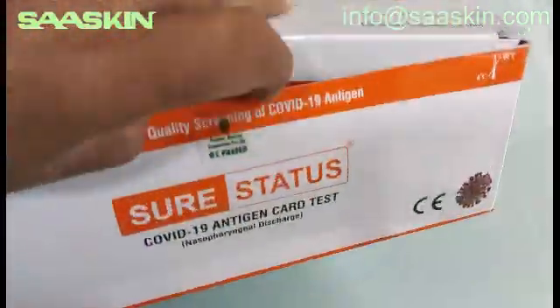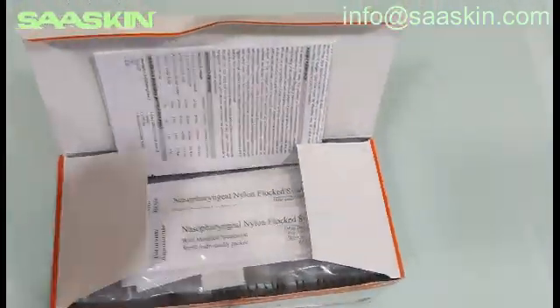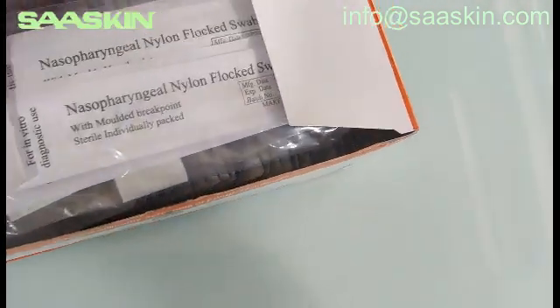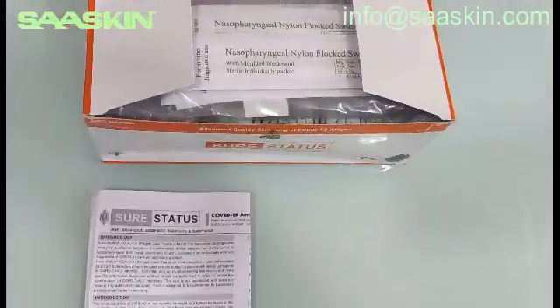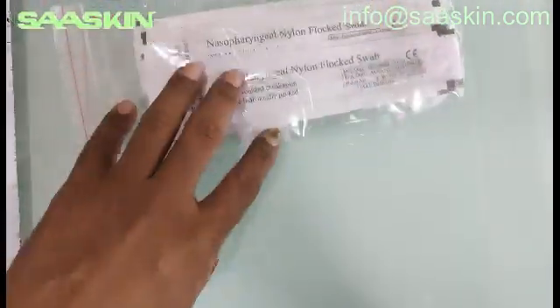Okay, let me open this for you. You can see an instruction manual — the SureStatus instruction manual. There is an instruction manual, and you can see the nasopharyngeal swab sticks — 25 test sticks.